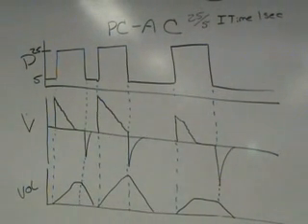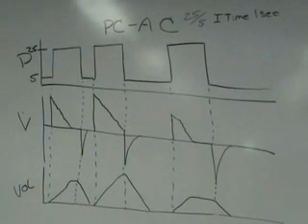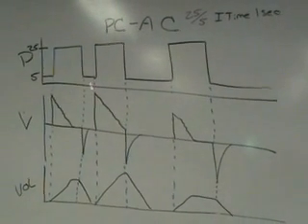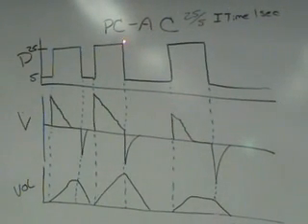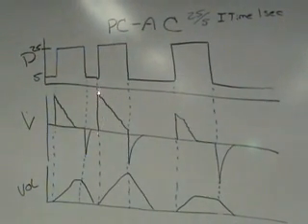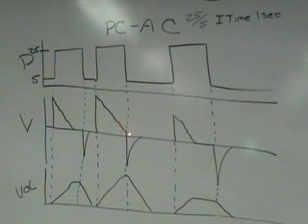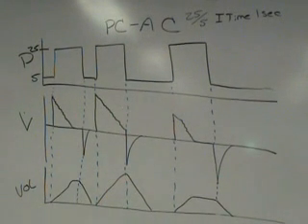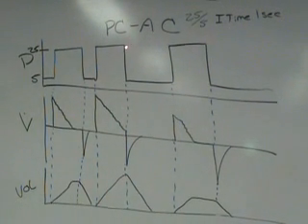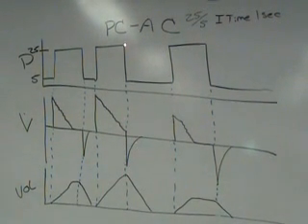My second breath, I tried to demonstrate that the flow doesn't have to zero before the end of the I time. Right? In this case, the patient triggered it, went to the pressure level, stayed at the pressure level for the set I time. The flow rate started off high, decelerated. There was still flow going in, and there was still volume being delivered when the I time said shut off. And so at that point, the volume came back out, the patient exhaled, and the pressure dropped back down to my baseline pressure.